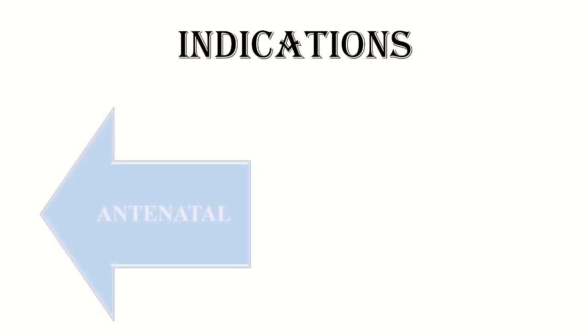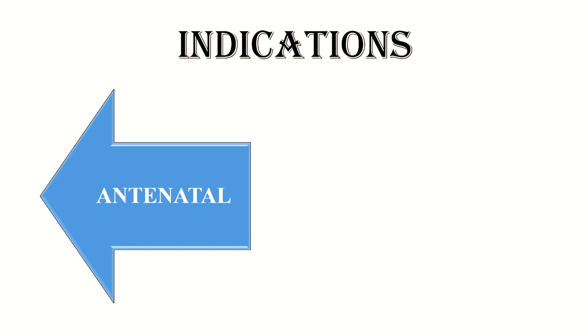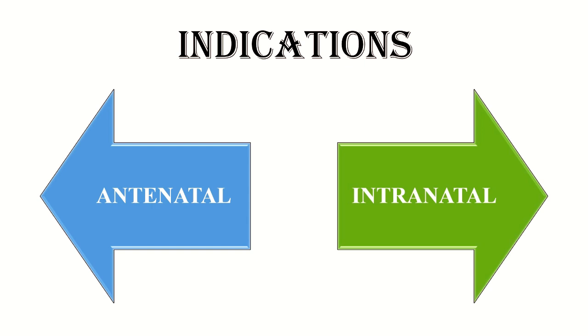Next, the indications can be categorized under two headings. One is the antenatal indication and the other one is the intranatal indication. One by one, we will see what are the conditions that come under these two categories.